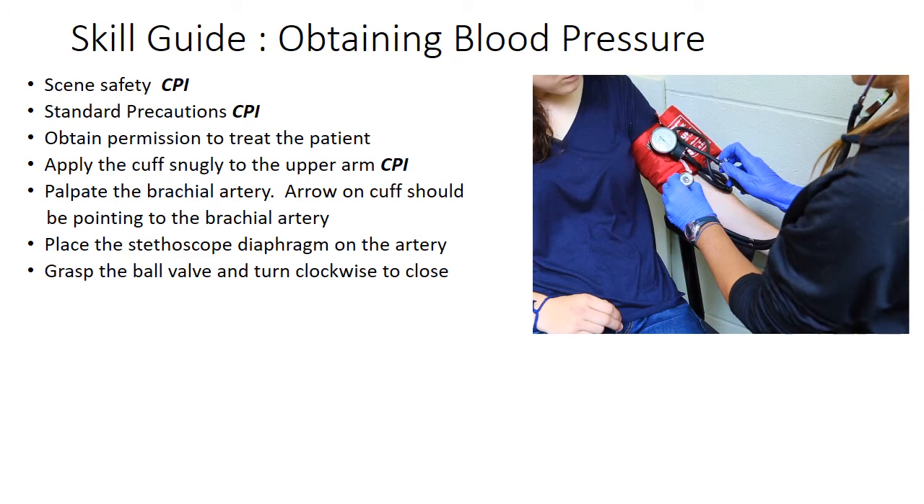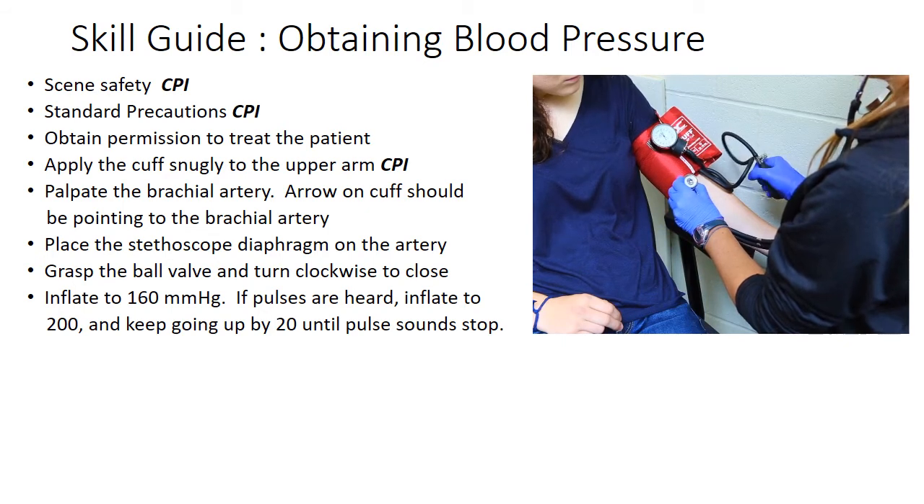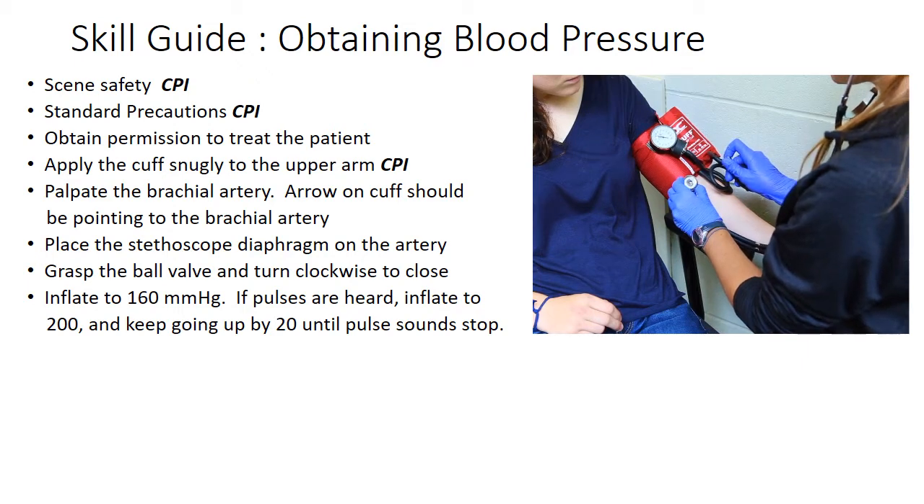Grasp the ball valve and turn clockwise to close. Inflate the cuff to 160 millimeters of mercury. If pulses are heard, inflate to 200. Keep going up by 20 until pulse sounds stop.